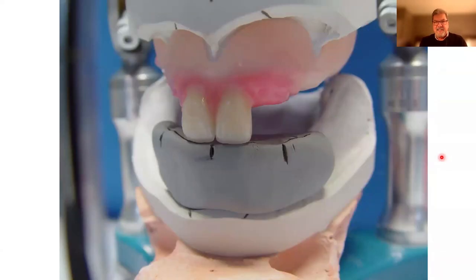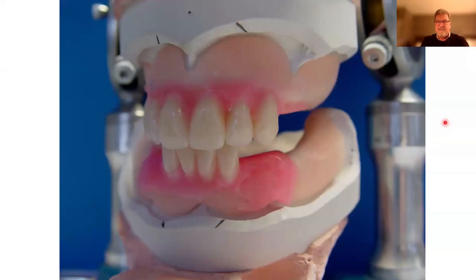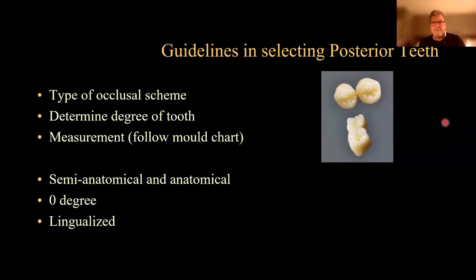I'm setting my anterior teeth right to that putty index, and this is probably about 26 millimeters from the periphery. The patient wanted to show a little more teeth on this particular case. So my centrals, my laterals, and my cuspids are touching the exact area where the doctor contoured the occlusal rim, so I know this is good. I kept that occlusal rim just in case I was questioned about it, and I also have that putty matrix. Then I'm going to set my lower denture teeth following the guidelines of the upper.